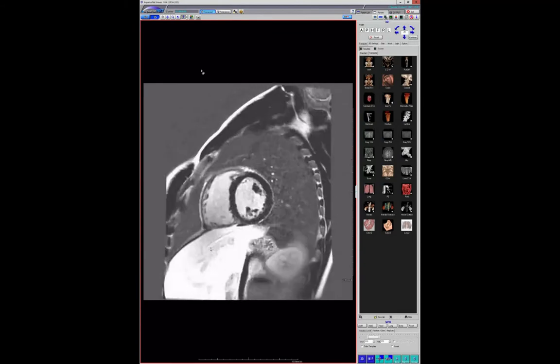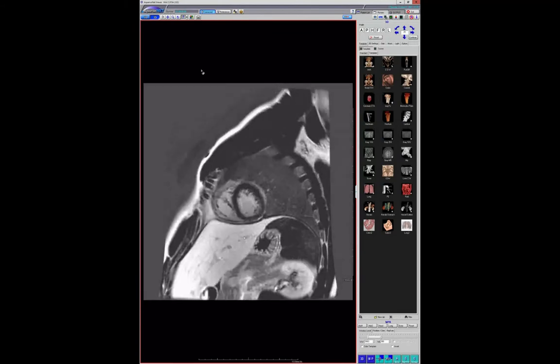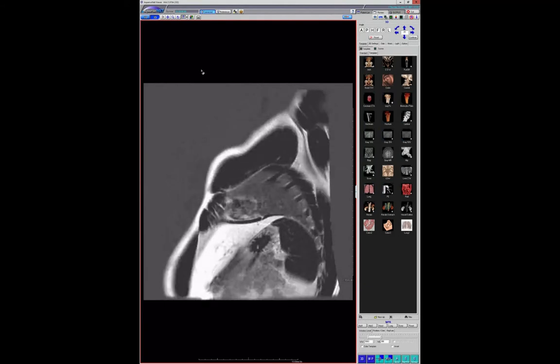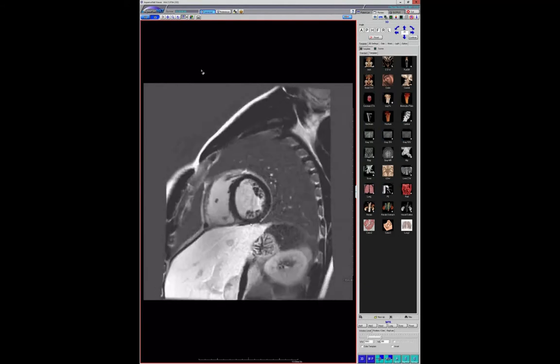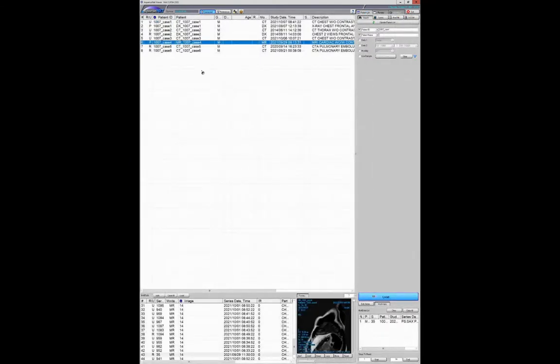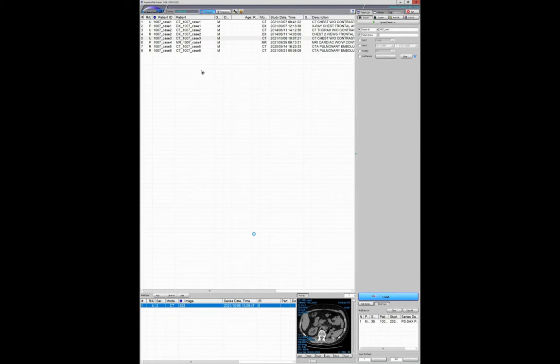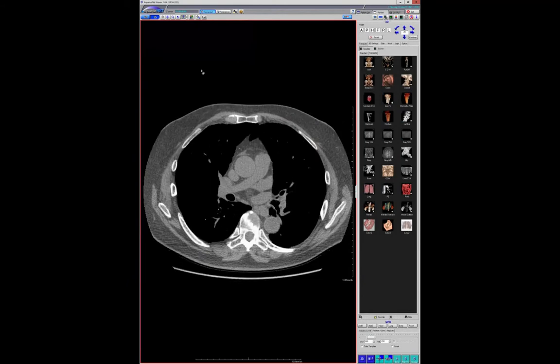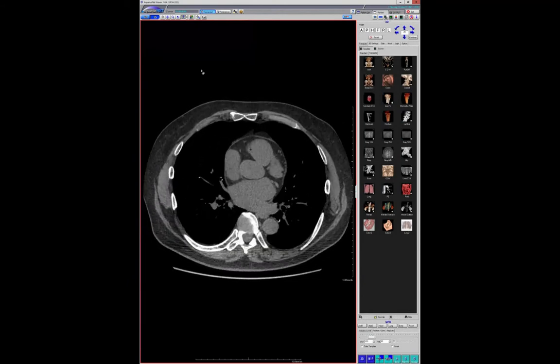The other thing I'd like to point out is, one of my fellows thought there was this huge effusion everywhere with this stuff as well. But in fact, this is just a very, very well thick diaphragm that I'm sure he needs for his water polo playing. But I don't know if anyone else has seen that. It's the first case I've come across with that. And it's nice to know that this is, I don't know if it's normal. They don't know what the long-term outcome is, but at least it's reported to occur in a high percentage of endurance athletes. So that was very helpful. It was a big weight off my shoulders, because I don't want this kid to lose a scholarship or be not allowed to play.